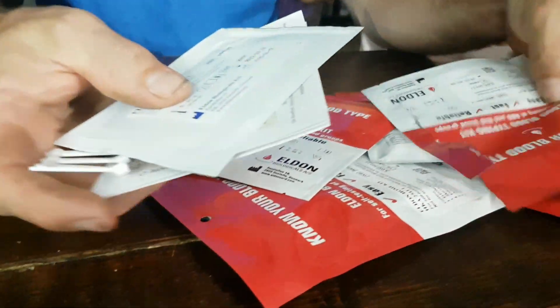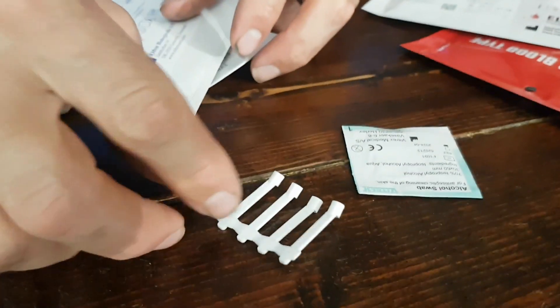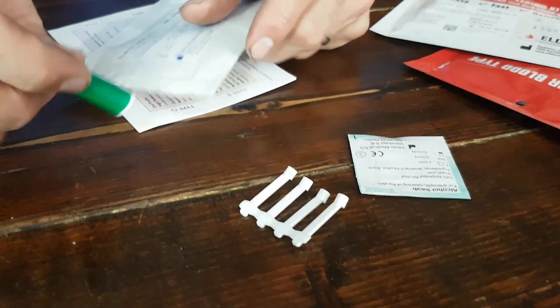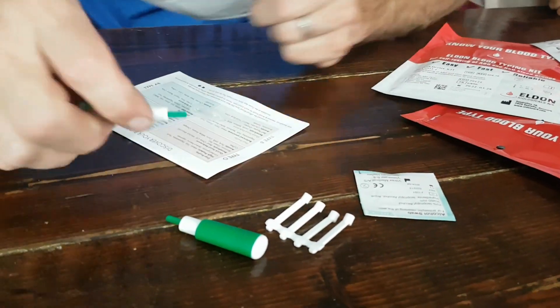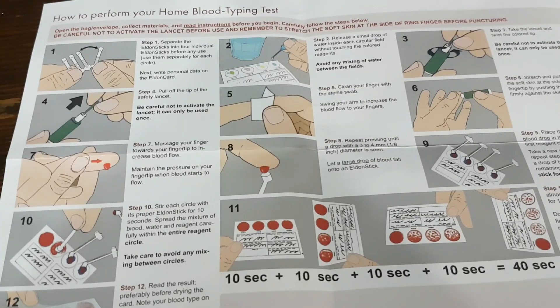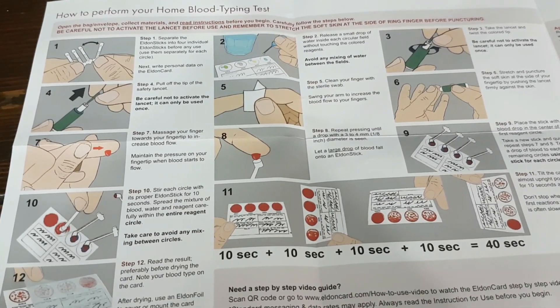Let's see what all is in here. We've got an alcohol prep pad, and these must be the test things. They seem to have pretty decent instructions — it's got one through twelve steps here. The reviews on Amazon said that it's important to follow the steps properly.